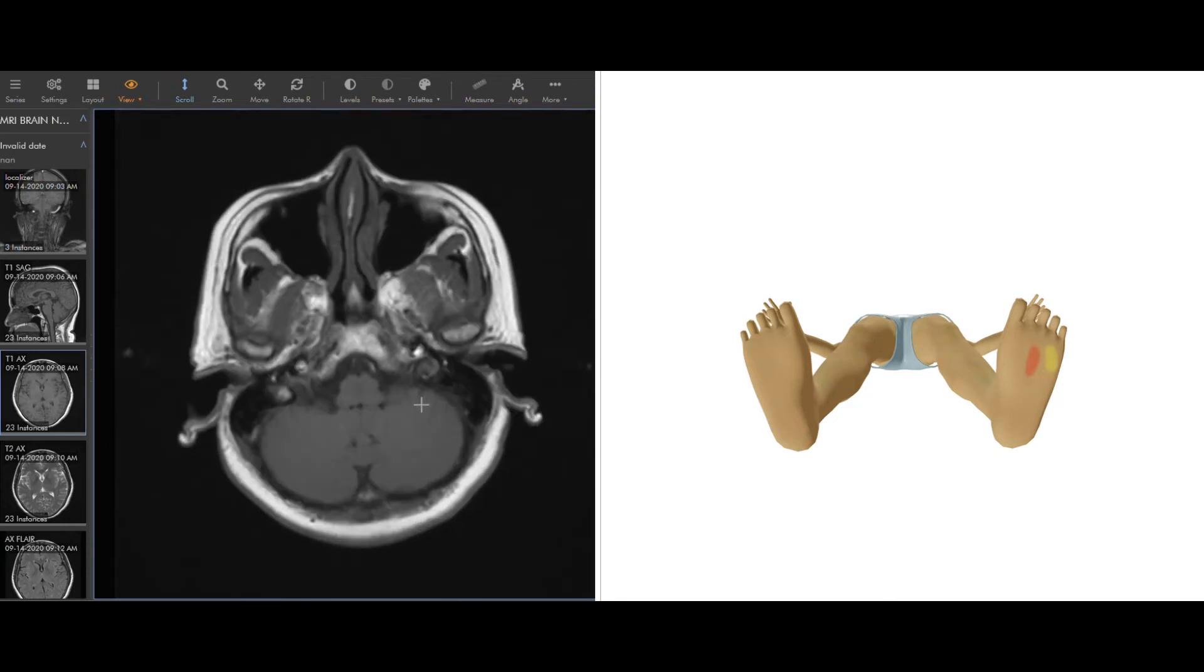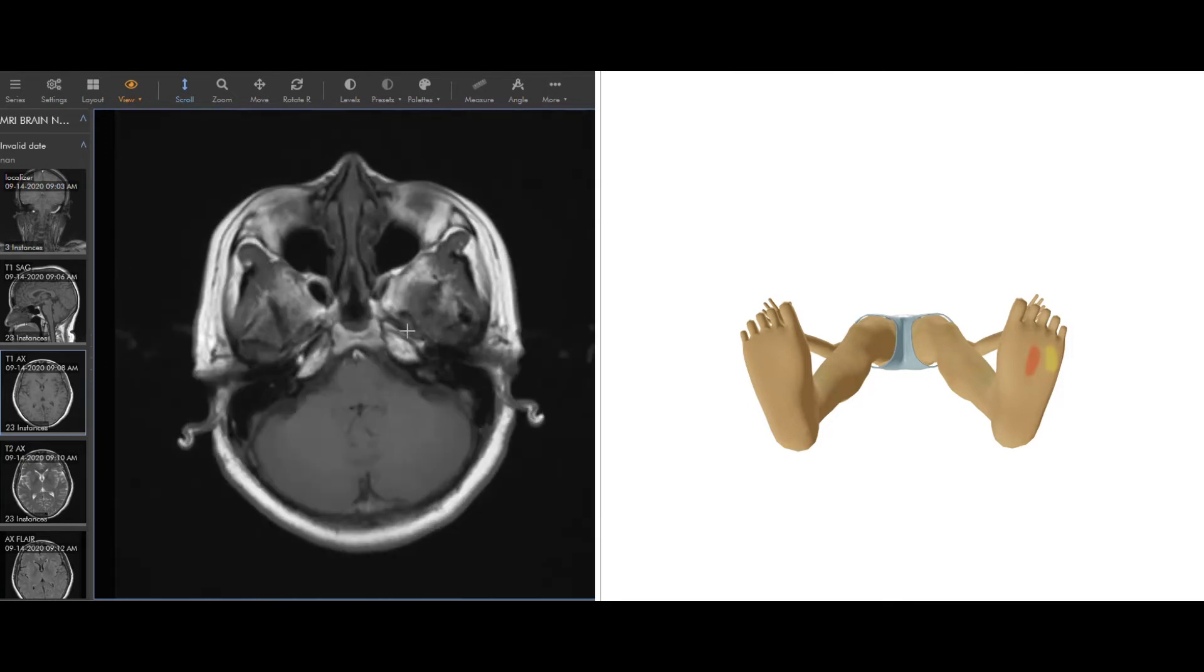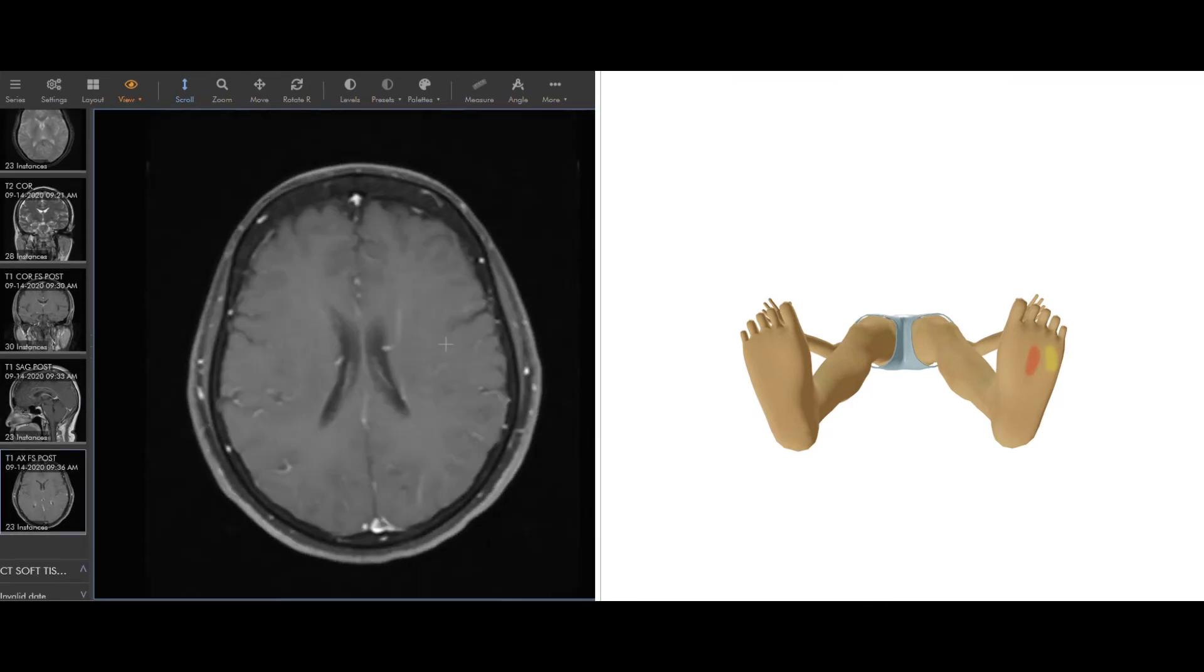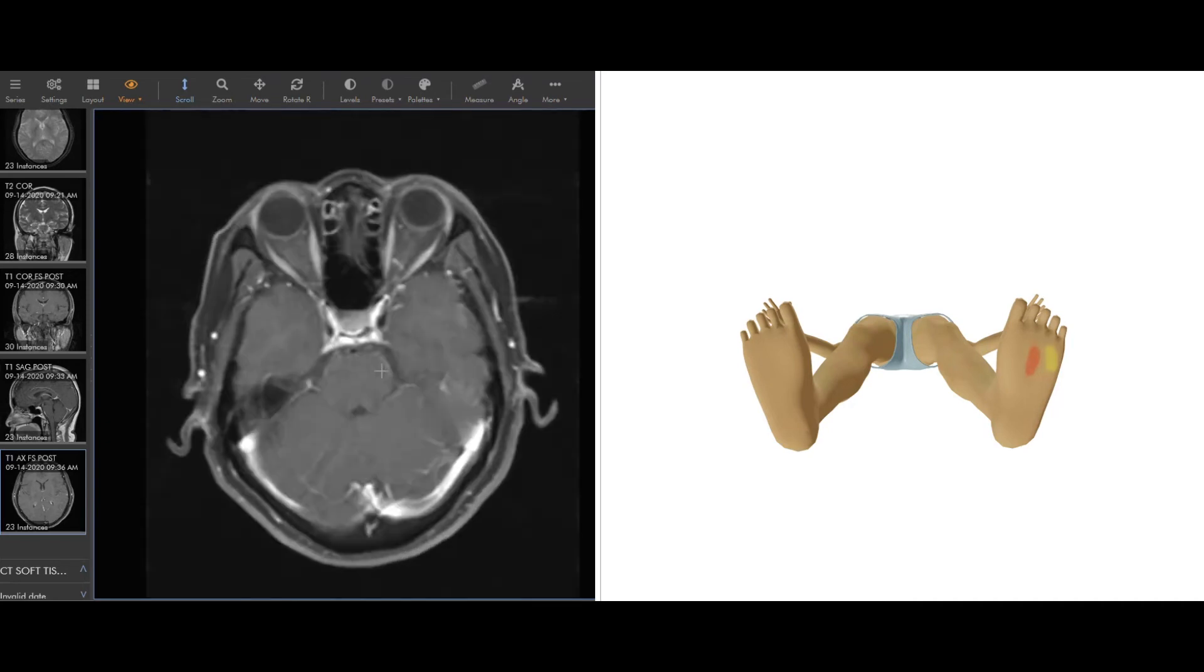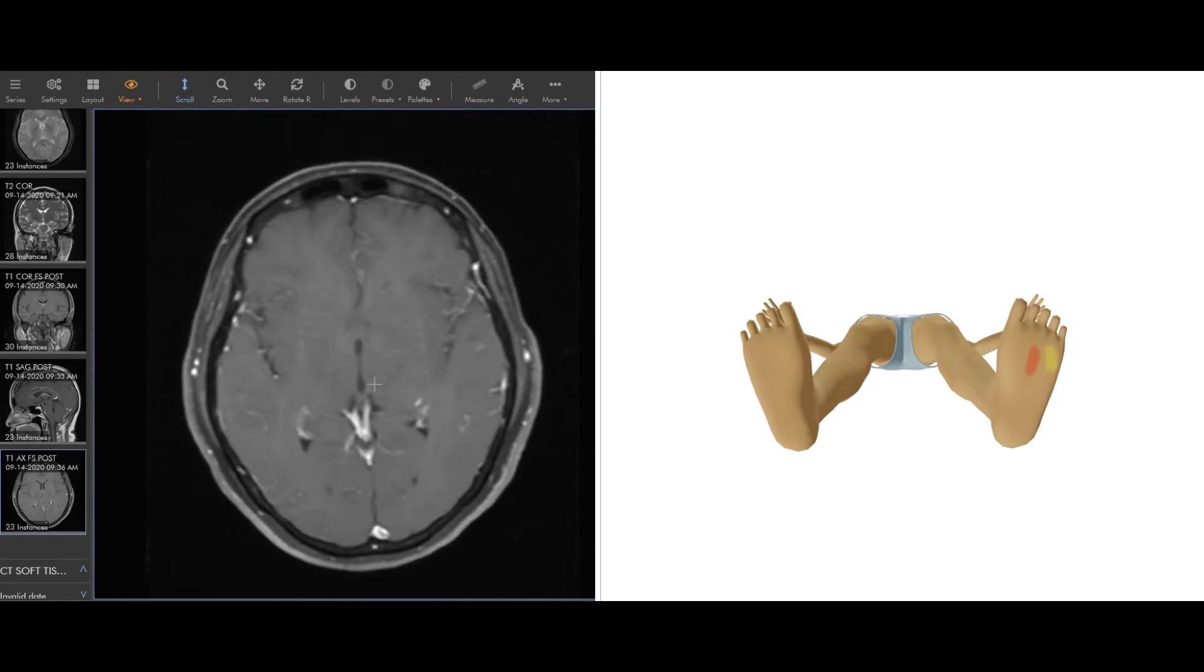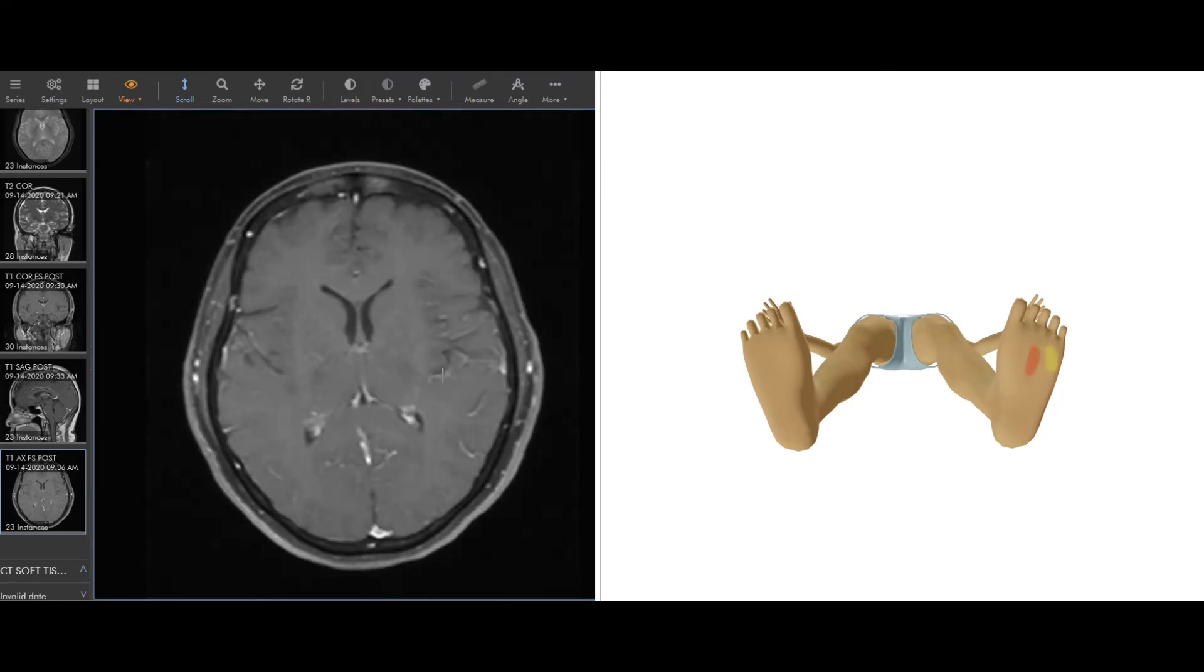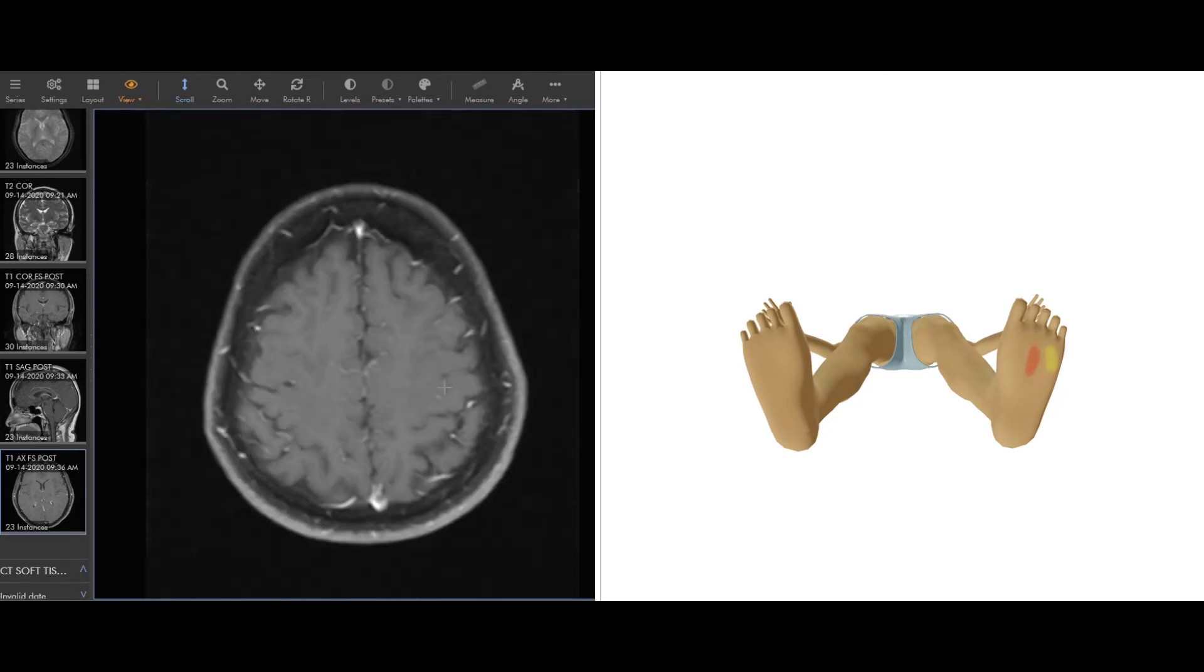That's the T1 sequence. Of note in the brain, the T1 sequence is what's typically used to give contrast. So if we have a contrast enhanced sequence like this one, it's like a T1 except you can see all these linear or straight line looking things. This is contrast within the blood vessels. So things that would have blood flow to them are now going to be bright. That's the point of the contrast. The reason for that is the T1 images don't really show much of anything because the colors are all close together, so the contrast helps bring out things like blood vessels or tumors or infection.